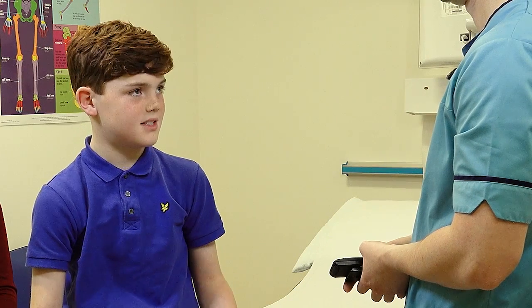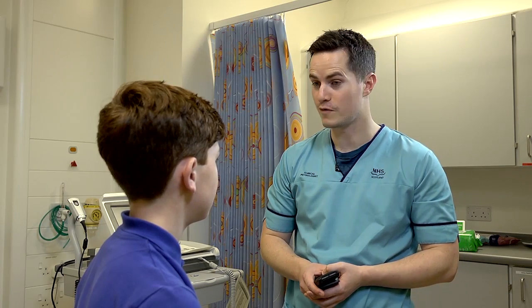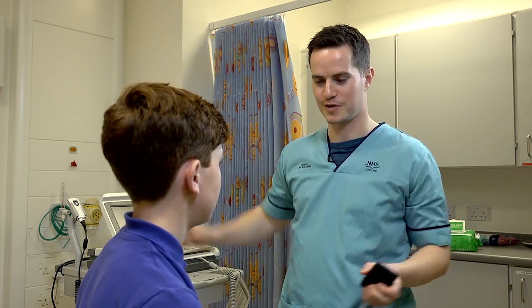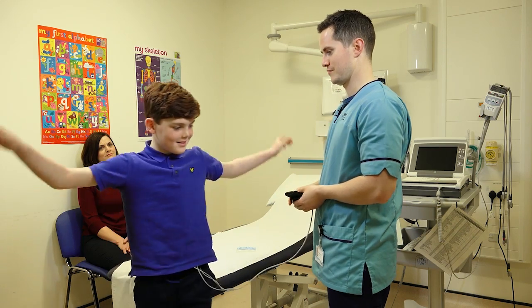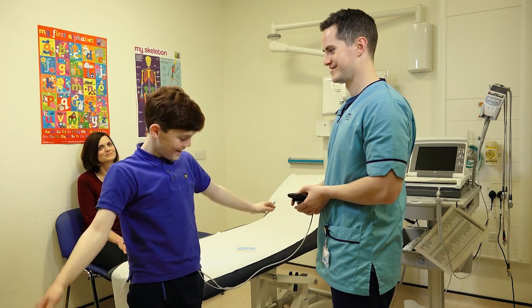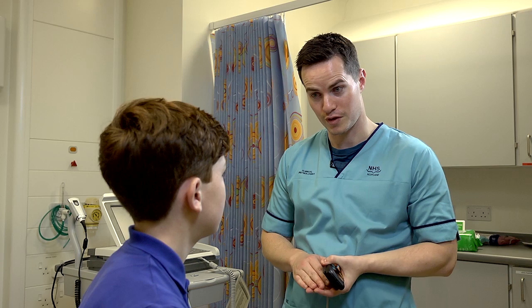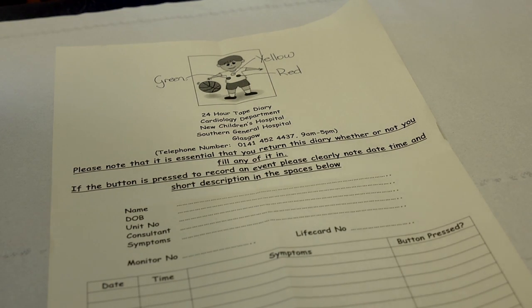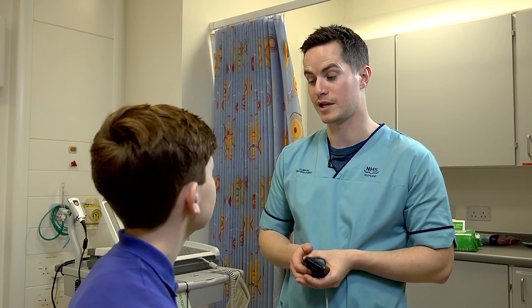Will any of these stickers fall off when I'm doing sports? The stickers shouldn't fall off, but we'll get you to wave your arms about like this just to make sure. Are they still on? Yeah. Good. If you do find any fall off, there's a diagram at the top of the diary — the wires are colour coded and they can just be stuck on again with the spare electrodes we'll give you.